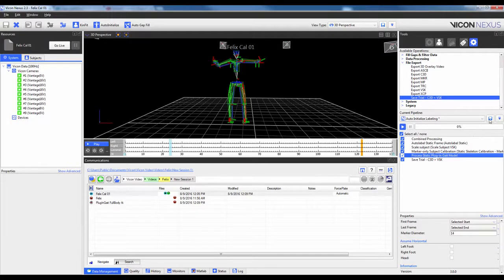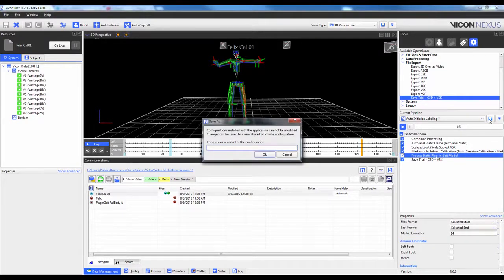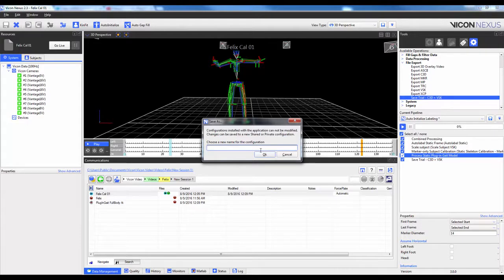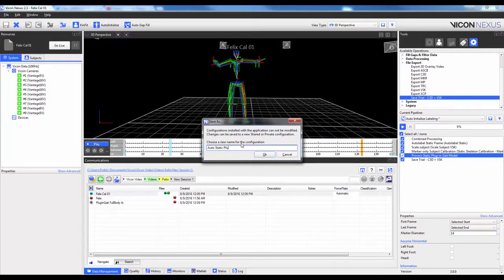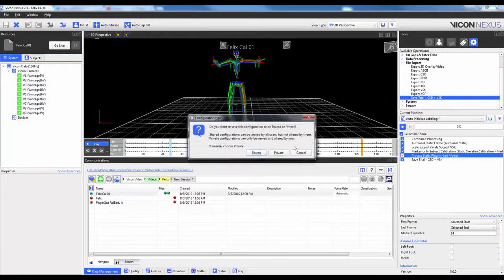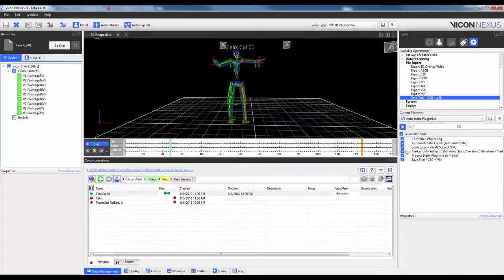Now, so I'm going to save this as a new pipeline, I'm going to press that Save button, it's going to ask me to put in a new name as I cannot save over any pipeline that's got this Nexus icon next to it, so I'm just going to call this Auto-Static Plug-in-Gait, and then hit OK. And I'm going to go ahead and make this Shared so that everyone has access to it.